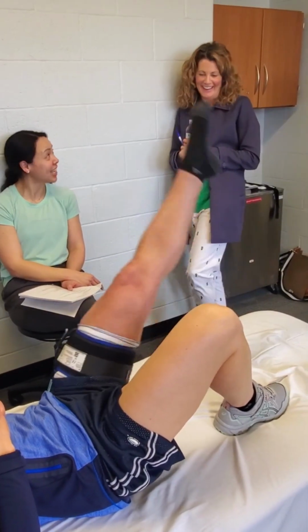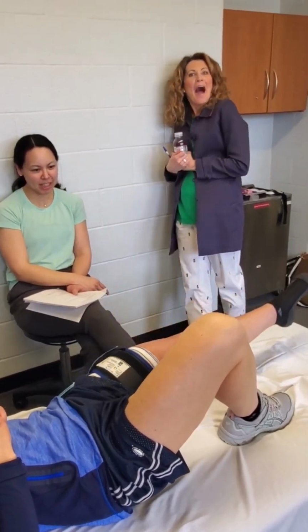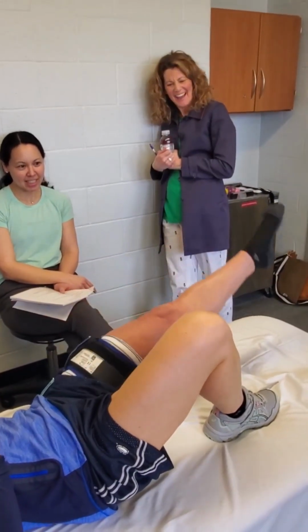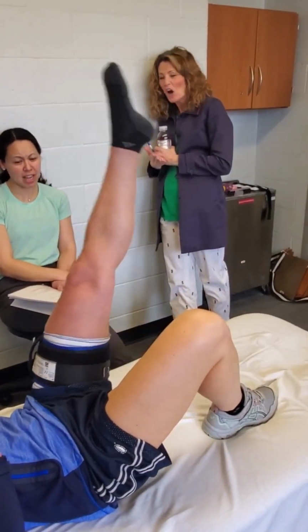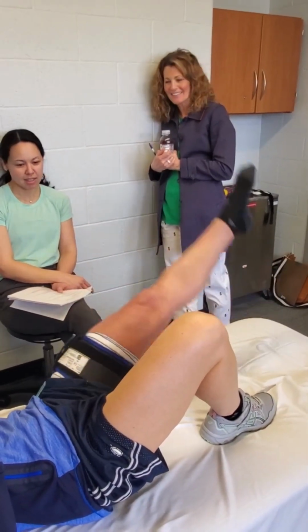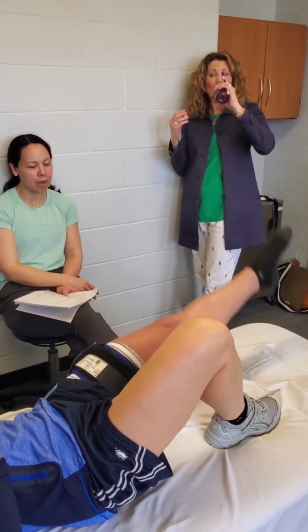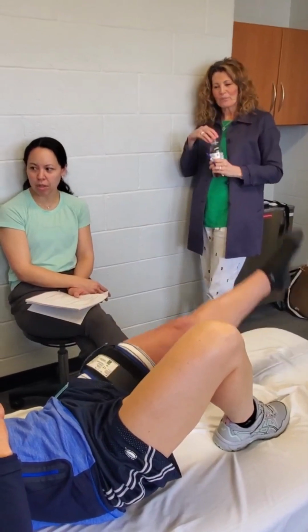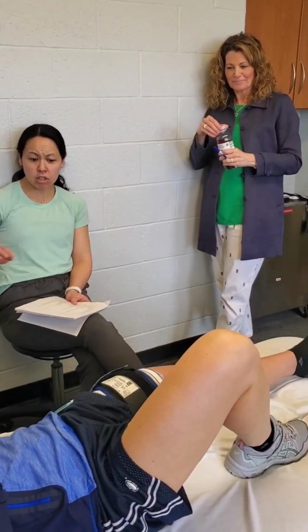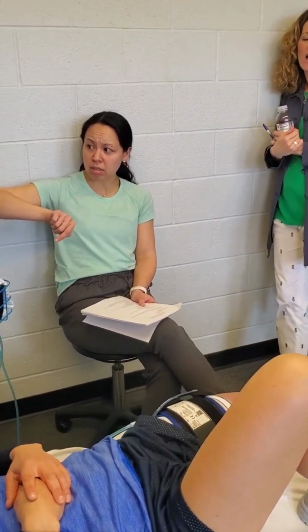You have to stop. Isn't it crazy? She's gonna walk around the rest of the day with one leg bigger than the other. And your leg feels kind of funny afterwards for a while. Oh, she's breathing, almost like Lamaze. You got this. Your leg feels a little funny for a bit, but then it goes fine. Last one? Yep. She's focused. And so then I would just hit deflate, and she's done.